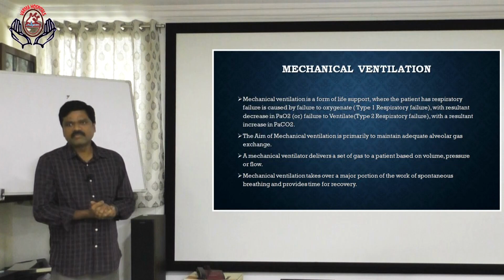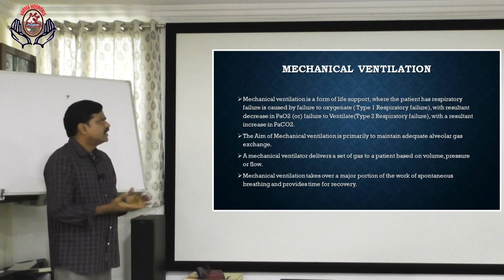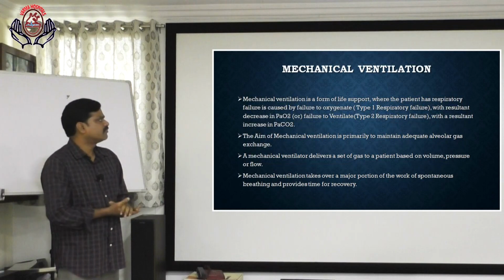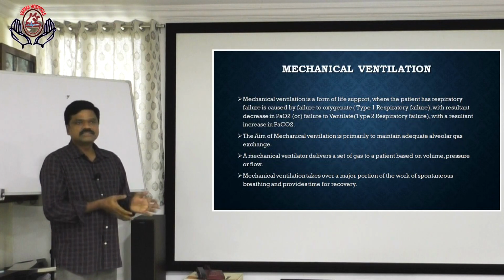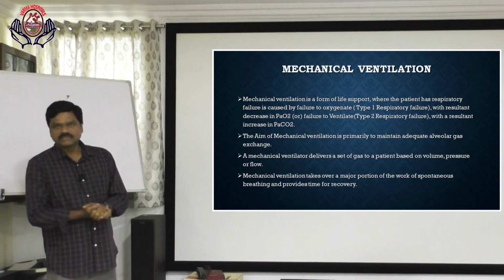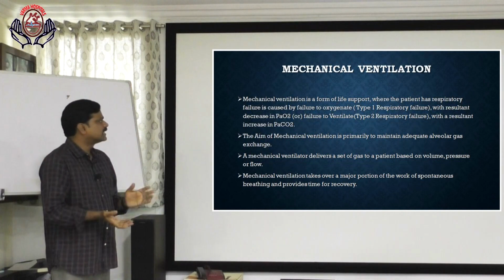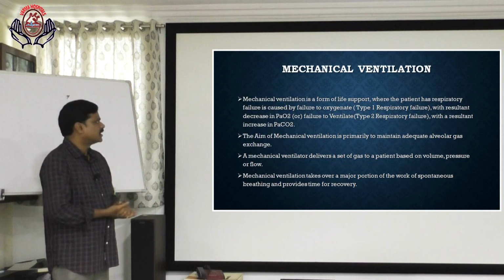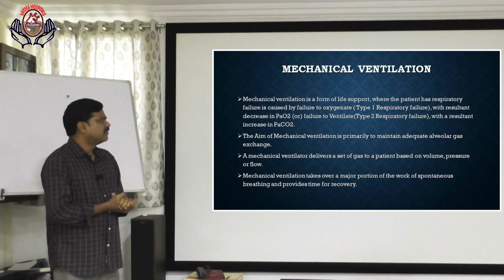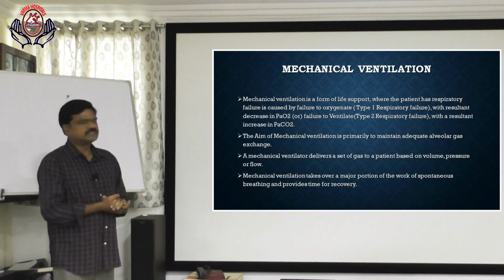Mechanical ventilation is a form of life support where the patient has respiratory failure caused by failure to oxygenate, type 1 respiratory failure, with resultant decreased PaO2, hypoxia, and failure to ventilate, type 2 respiratory failure, with the resultant increase in PaCO2, hypercarbia. The aim of mechanical ventilation is primarily to maintain adequate alveolar gas exchange.